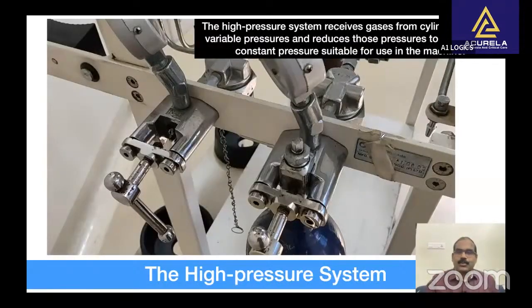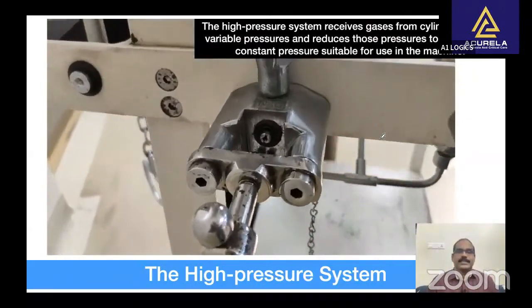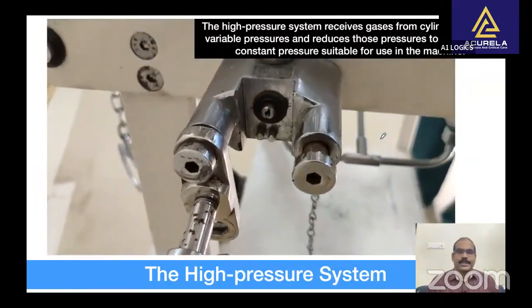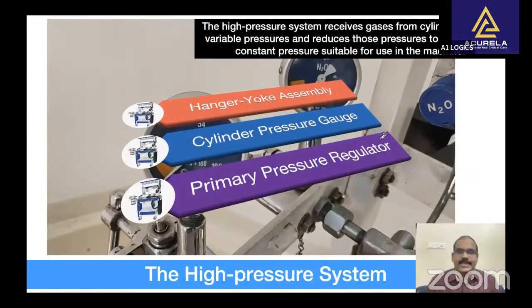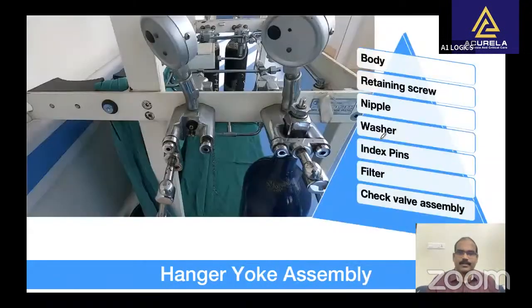Now, let us come to what makes the high pressure system. It receives gases from the cylinders at high variable pressures and reduces those pressures to lower, more constant pressure suitable for use in the machine. It consists of hanger yoke assembly, cylinder pressure gauge and primary pressure regulator. The hanger yoke orients and supports the cylinder, provides a gas tight seal and ensures a unidirectional gas flow.